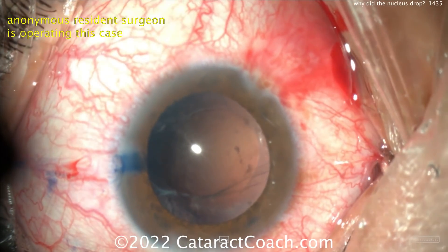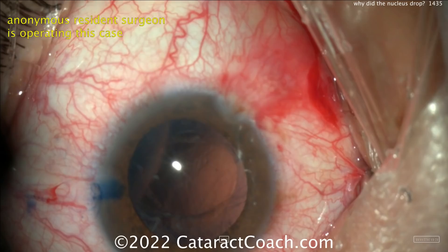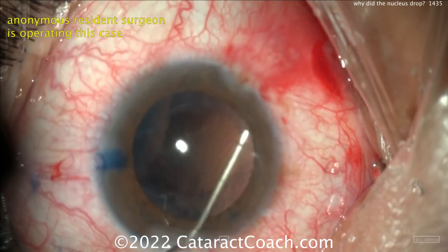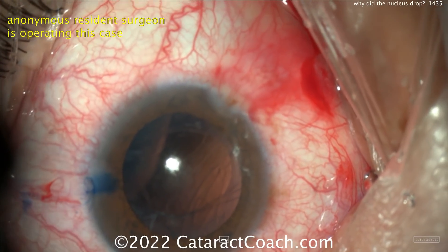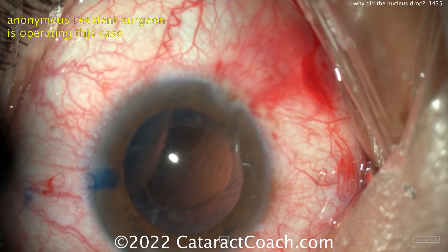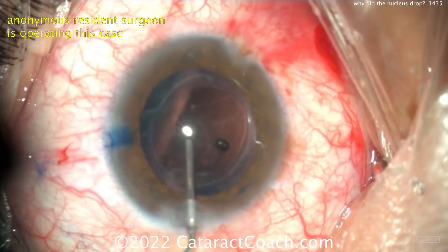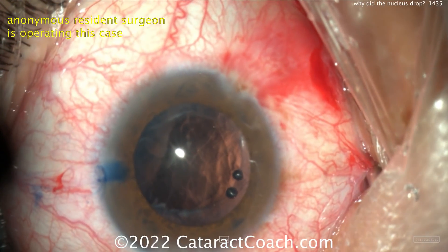You didn't need to pull the phaco probe out, but I do agree — let it go. It's okay. Your vitreous surgery colleagues are going to go in there, do a full pars plana vitrectomy and full pars plana lensectomy. It'll be fine. The patient will have a good outcome. There's no medico-legal liability in having this complication — it happens to every surgeon in his or her career. Do not fish for it with the phaco probe. It's already gone. Accept reality. Let it go.